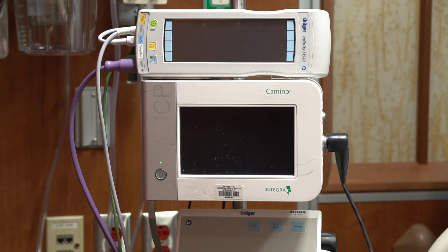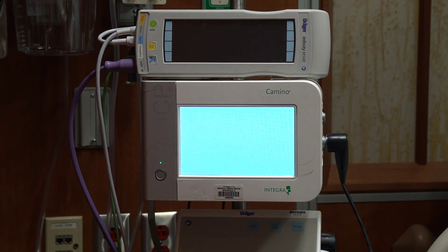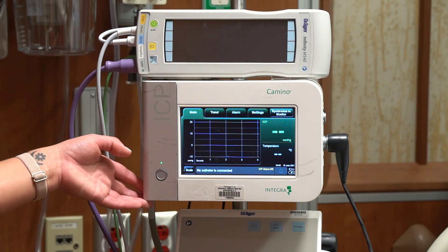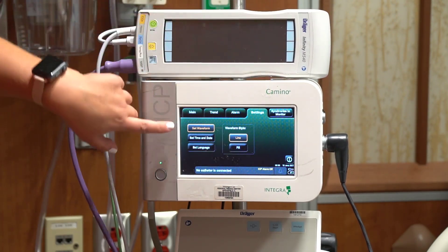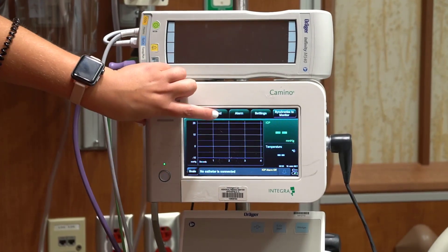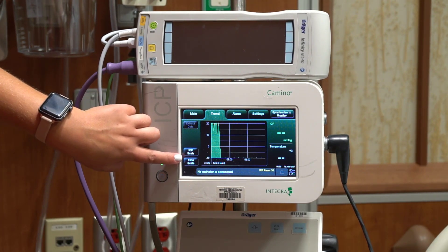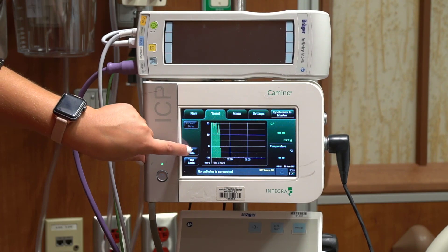Once all cables are connected — except the patient connection, which is the black cord — turn on the Camino. Once the monitor is initialized, you will come to the main screen. You can click the settings button to adjust the waveform to line or fill, and also change the date and time. There is also a trend button; the scale usually starts at negative 10 to 20, and you can click the ICP scale to change those parameters.